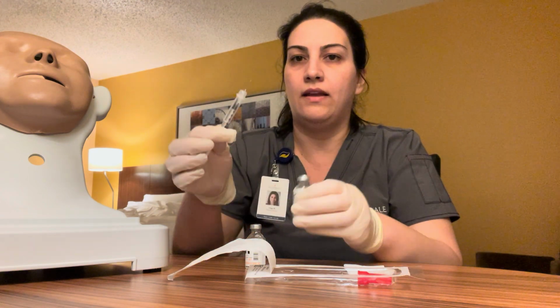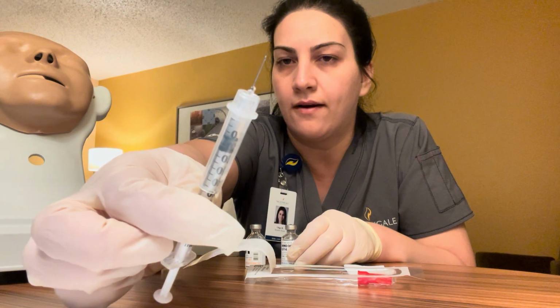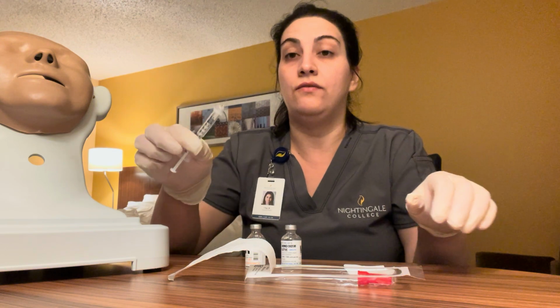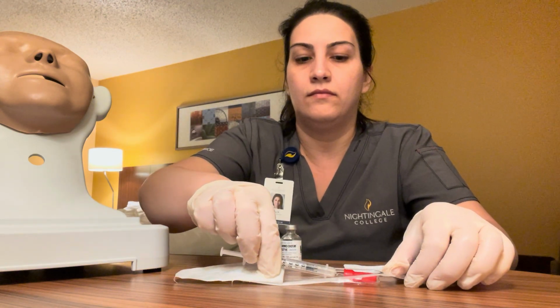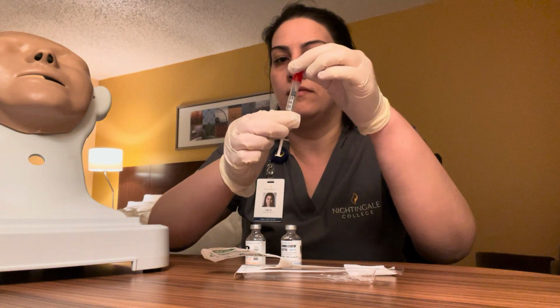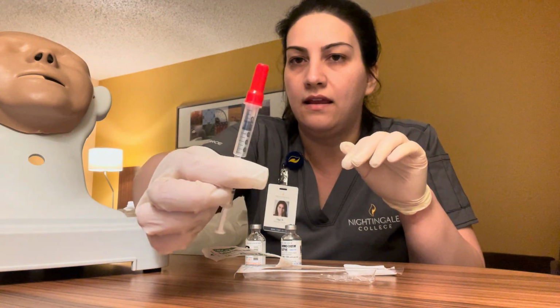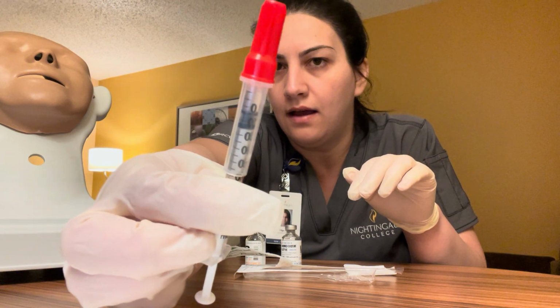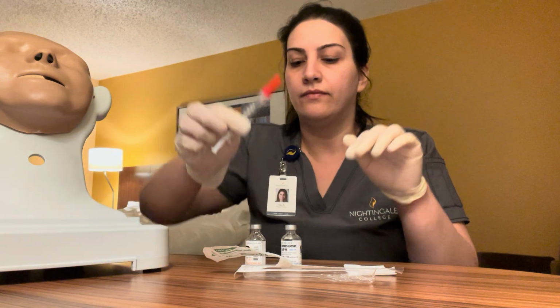8 units of intermediate. Nurse and I verify against the MAR. Next, we're going to use the scooping method. Nurse and I verify against the MAR, totaling 12 units of insulin subcutaneously for my patient.